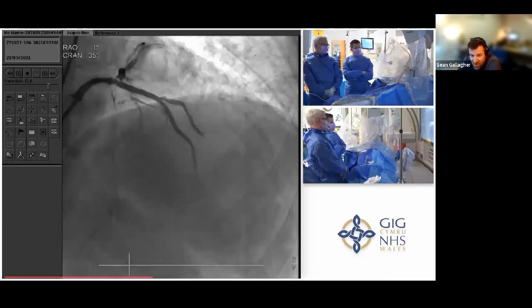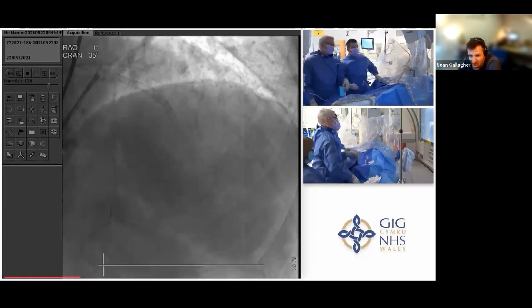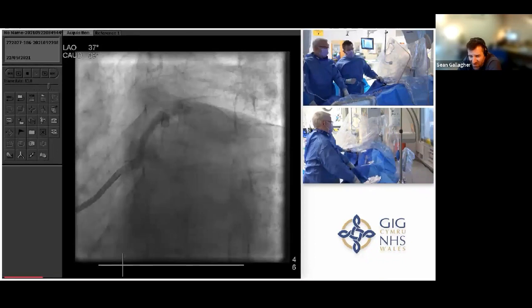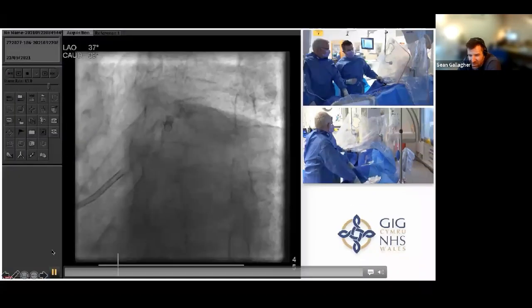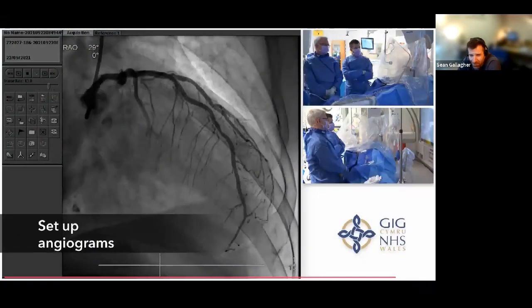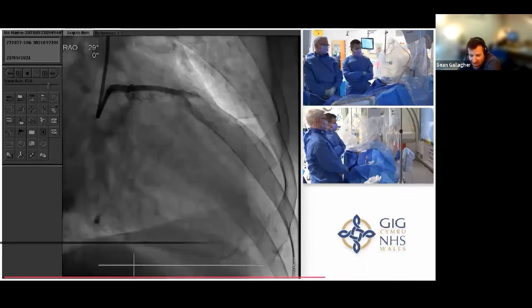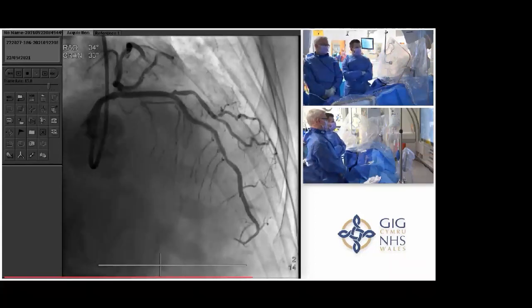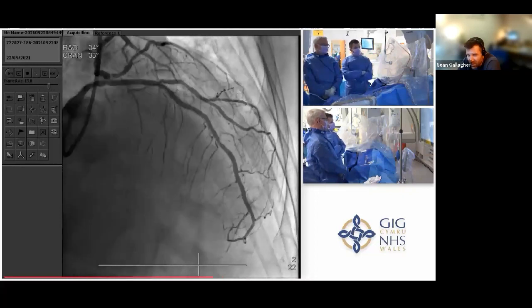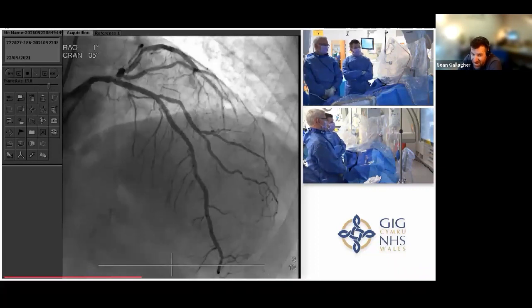What you can see now is the stent in the proximal LAD. At the front end of the stent, the left main doesn't look quite normal. And you can see a severe ostial circumflex lesion in what you could argue is a left main trifurcation, or you could say it was a very early OM. So initially, what are your thoughts, Andrew? I had some concerns here with how we were going to deal with what was in essence a left main trifurcation, but certainly some thoughts about the distal left main into that LAD stent and what might be going on there, because we simply didn't know.